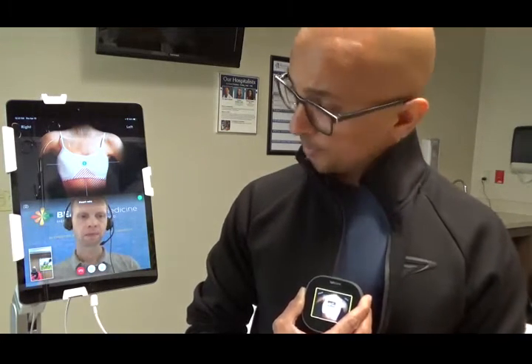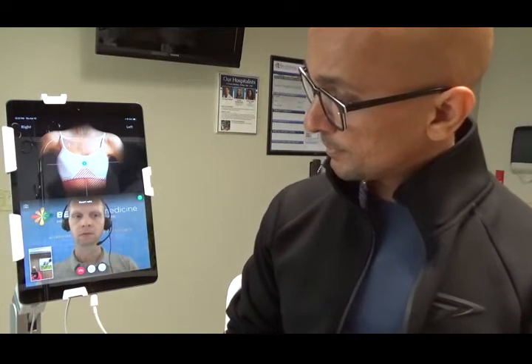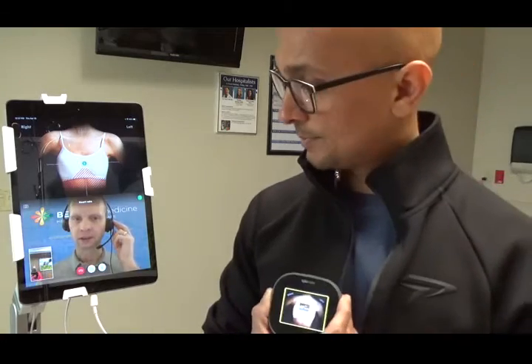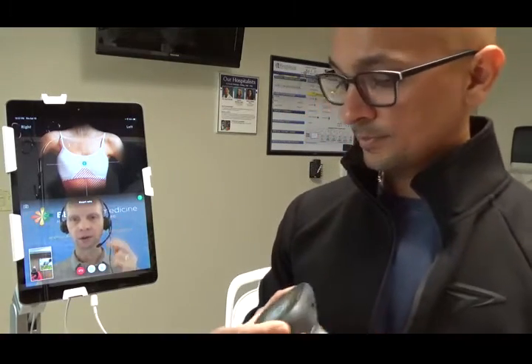I got 67. Did you get anything? I got the heart sounds and I got a recording in the heart rate.